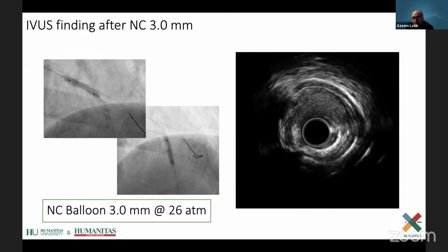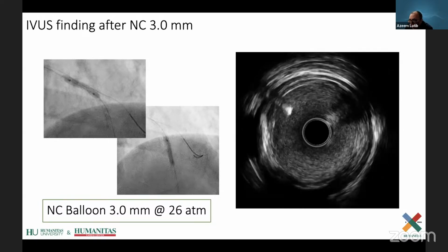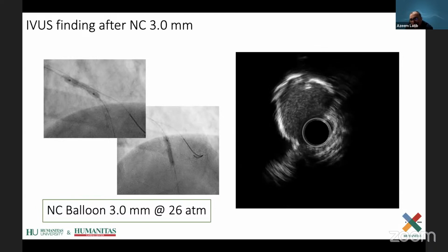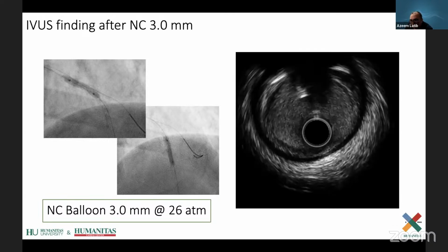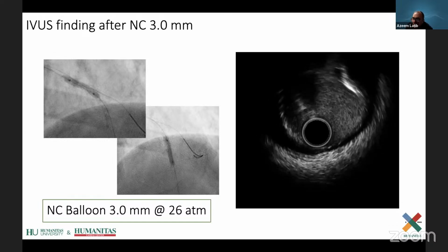I don't know, Patrizia, what do you think? I mean, I have a colleague here who does a lot of cutting after rota, and his perforation rate is very low. I mean, Patrizia, you've been doing this longer than a lot of us. Do you have concerns about using cutting after rota?